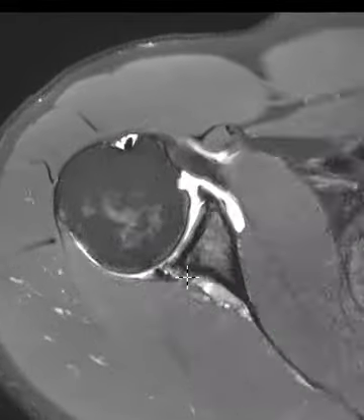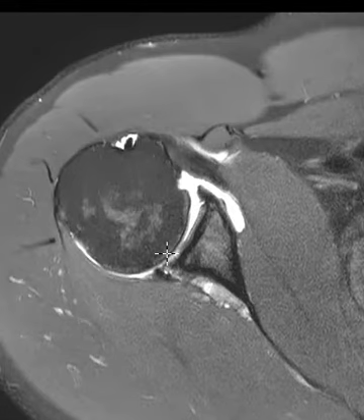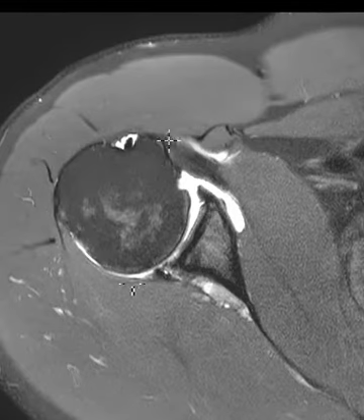He also has some posterior subluxation of the humeral head. The epicenter of the humerus is about right here, and the epicenter of the glenoid is way over here, so his head of the humerus is subluxed posteriorly — and that is related to laxity of the joint capsule.